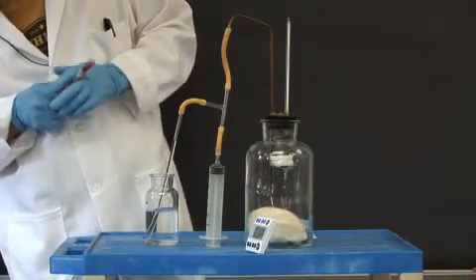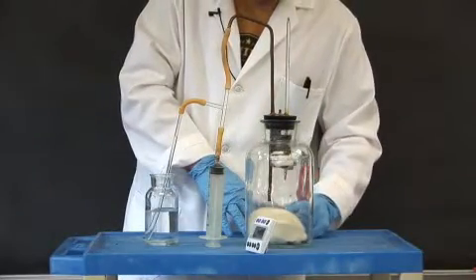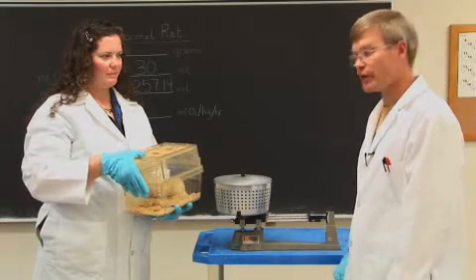We're coming up on our 30 mil point right there. We've just passed it. 7 minutes. At the 7-minute mark, this rat consumed 30 mils of oxygen. We have determined that 30 mils of oxygen were consumed in 7 minutes.